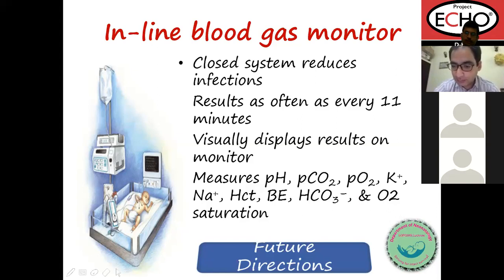We have a question from Dr. Rafiq. He asked about PO2. Is PO2 reliable in CBG? Ideally it would be an arterial sample, but yes, if an arterial sample is not there, then a capillary sample is almost, you can take it as a marker.